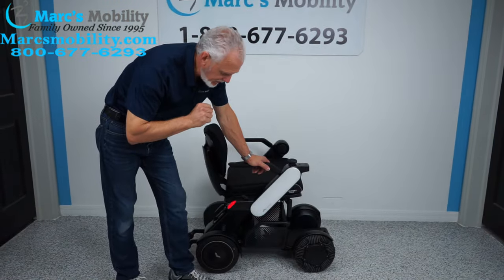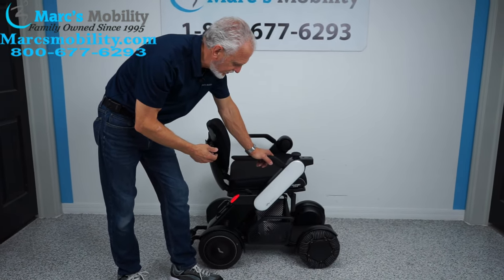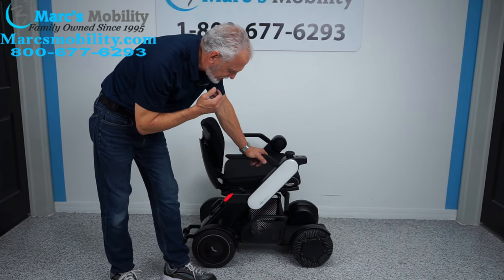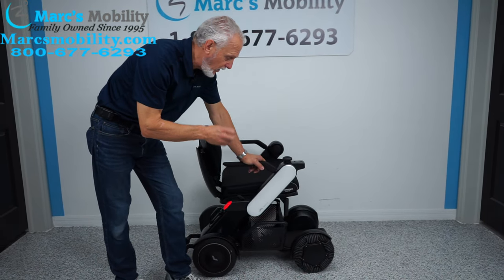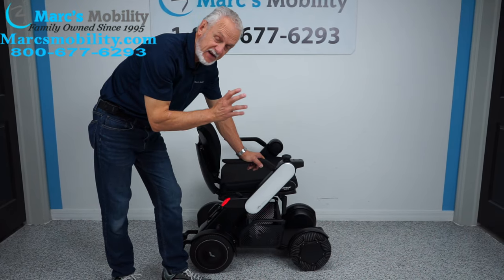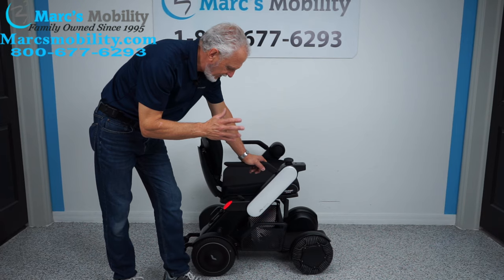A couple more things about this power chair. The ground clearance is 2.2 inches. This power chair comes in six colors — we have the white here. It comes in white, blue, red, pink, and black. When you order the chair, let us know what color you want.